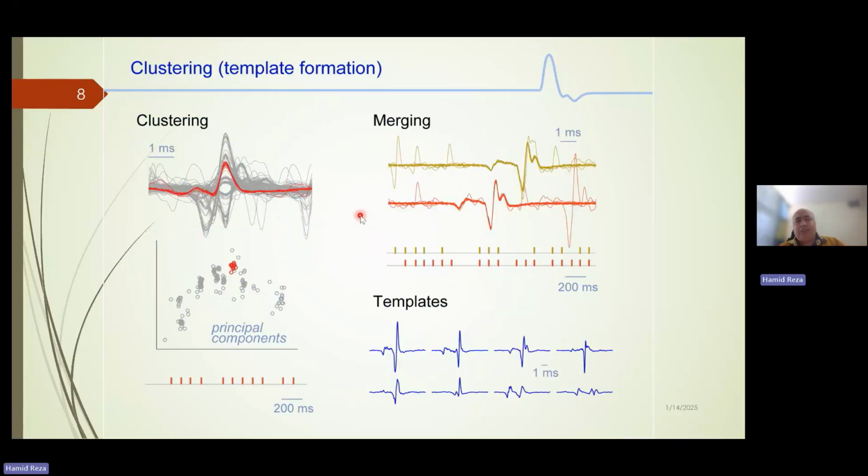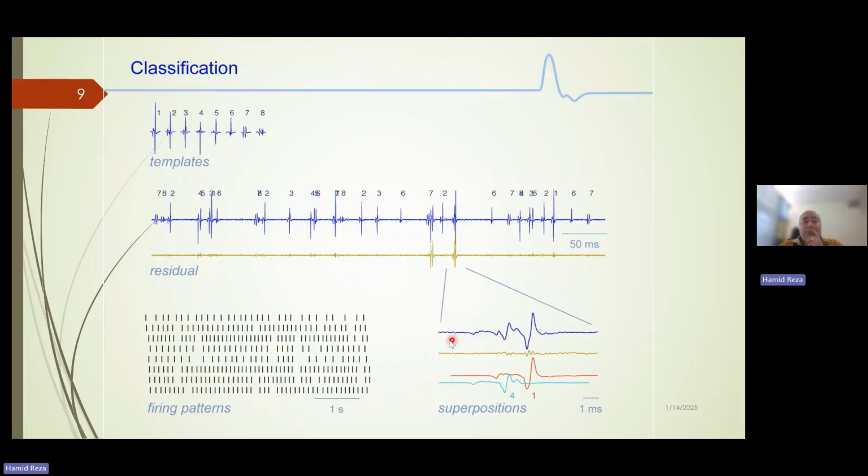When we do the decomposition, we will be able to identify the motor units. We will be able to identify the occurrence of each unit during time. We will be able to identify the shape of the motor unit, and then we can go back to the raw signal, and we can even extract morphological information from the raw signal. So that's why the decomposition is very important. So what we will get is something like this. And I will go through this procedure technically and clinically afterwards.